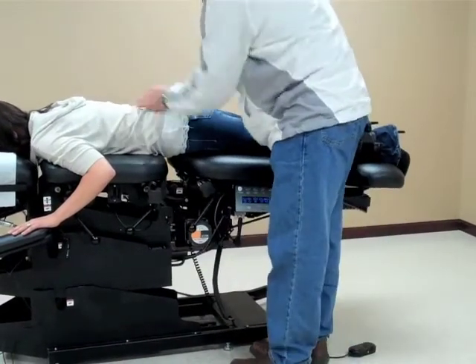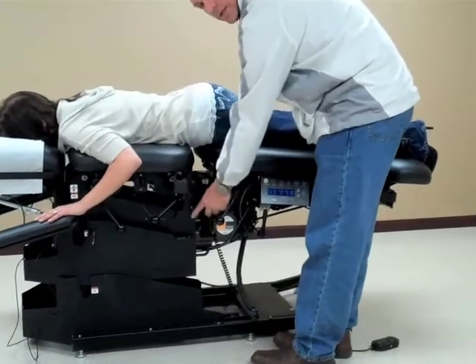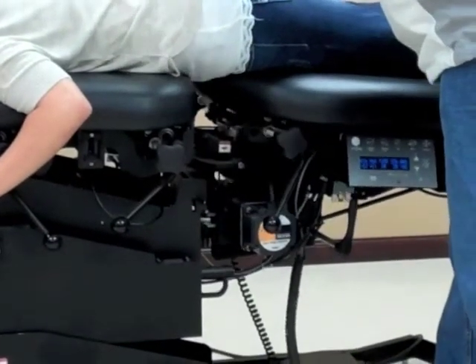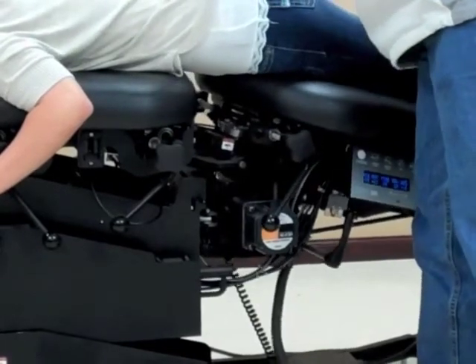I can also engage the lateral flexion by using the lever here to take a lateral bend and flex.